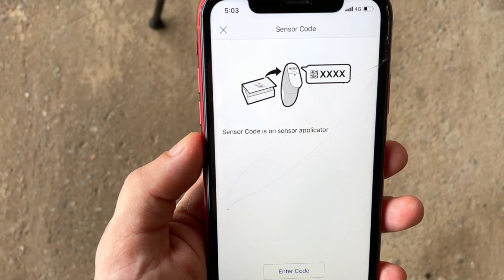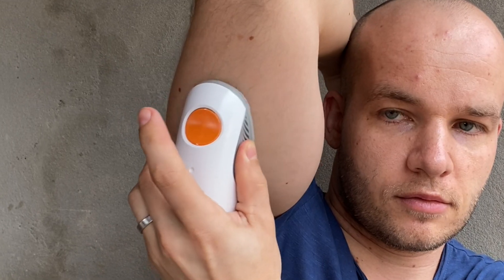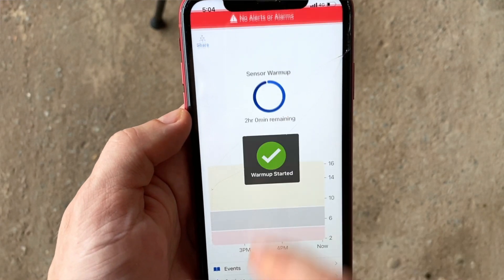With Dexcom G6 things get more complicated because there is an exact series of steps you need to take. First you let the system know that you're going to change the sensor, then you need to pair the new sensor with your device, remove the transmitter from the old sensor, apply the new sensor, connect the transmitter to your new sensor, and start the new sensor on your device. It's not rocket science either, you can still do it, but comparing it to Libre 3 makes Dexcom G6 seem unnecessarily complicated when it comes to insertion. I have detailed videos where I walk you through application of both Libre 3 and Dexcom G6 — I will link them in the video description.